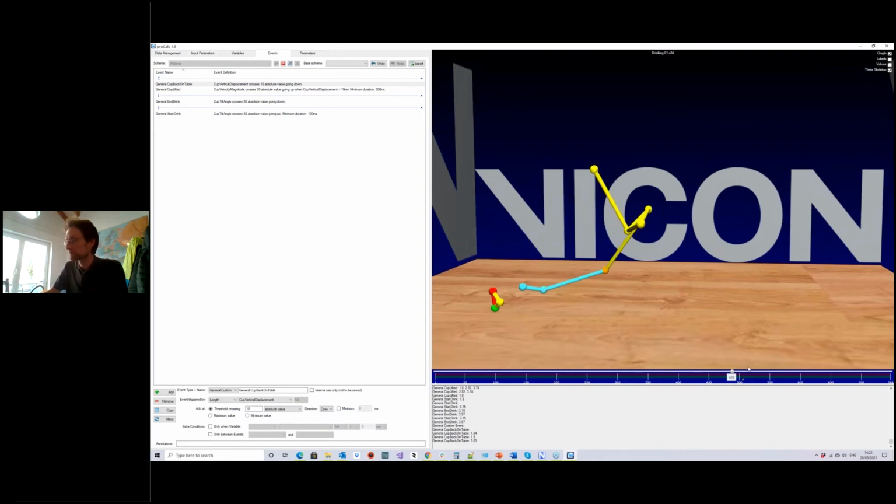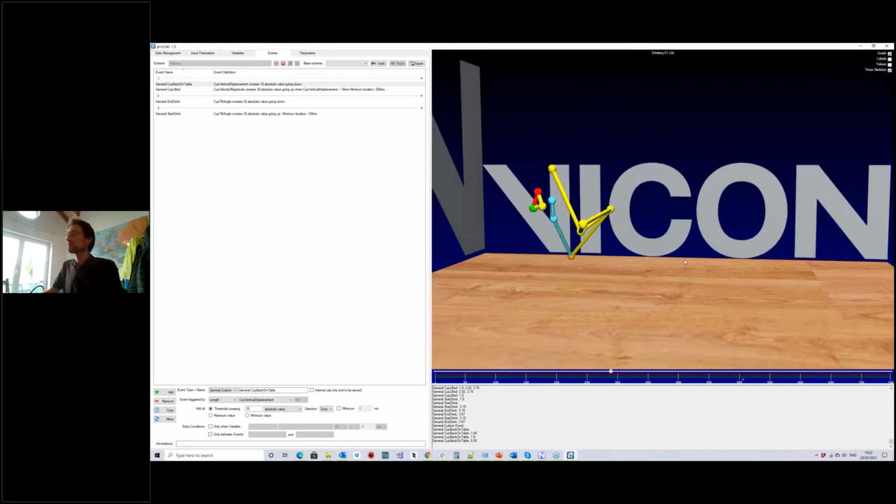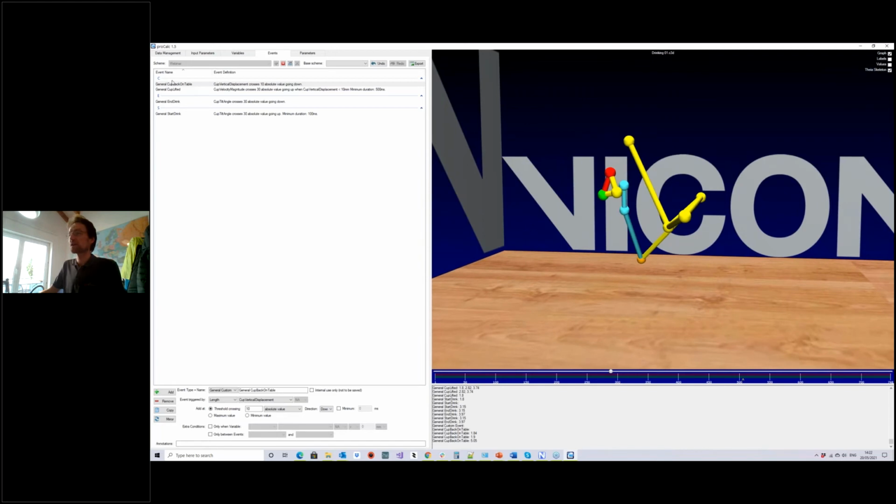So basically when the person is putting it back on the table like that. Okay, so those are the 4 events that I'm interested in this case: grabbing the cup, starting the drink, ending the drink, and putting it back on the table, basically.